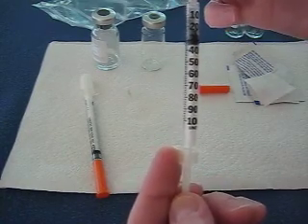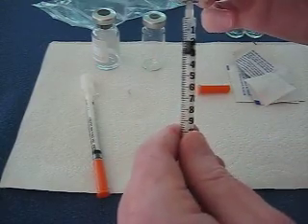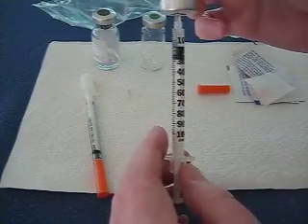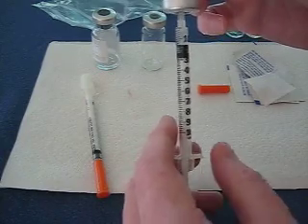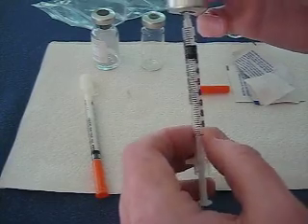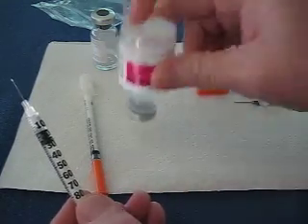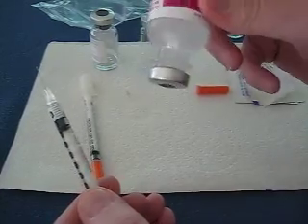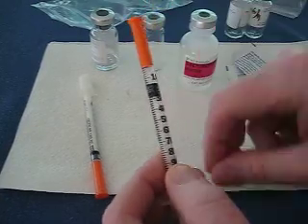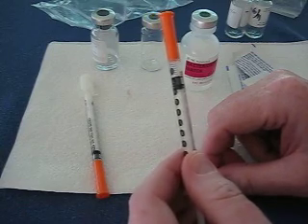You've got to go a little slow. Sometimes people say, what if bubbles form inside? The nurse told me bubbles aren't as critical when you're going under the skin. But if you're going into a blood vein or blood vessel, bubbles are very critical to avoid. Under the skin, she said it's not as much of an issue, so I just don't worry about it unless there are really big ones. So I've got this filled to 15 — I pull out the needle, and it's still holding the fluid in. The needle's ready to inject. The injection part is going to be in part two of the video, so go watch part two because this one is over.